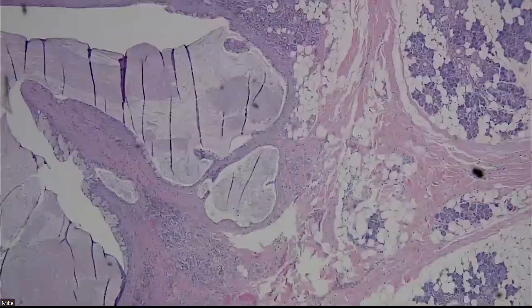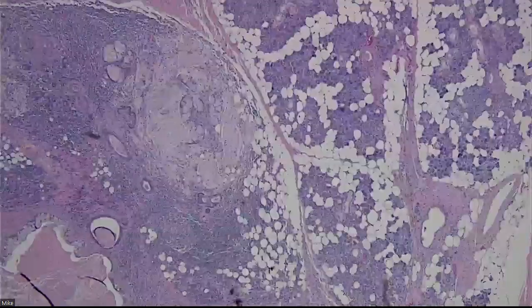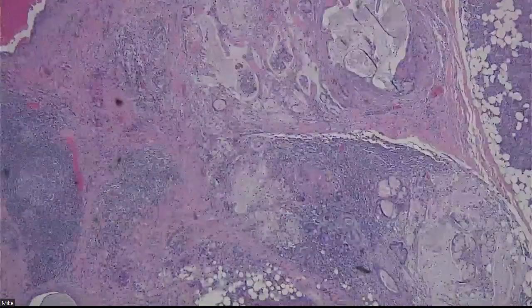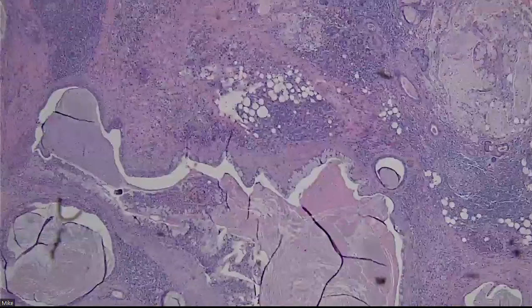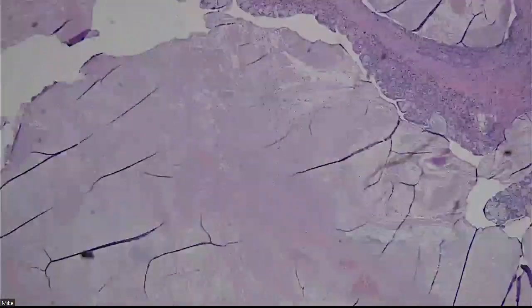What you picked up, Andrew, is saying it looks kind of squamoid. That's correct. That would be fine for mucoep. And you can get this extravasated mucin like you see here with these nests of neoplastic cells floating in it. That's totally okay for mucoep and doesn't make it a mucocele because the architecture is way too complex with small cysts, large cysts, branching, et cetera.